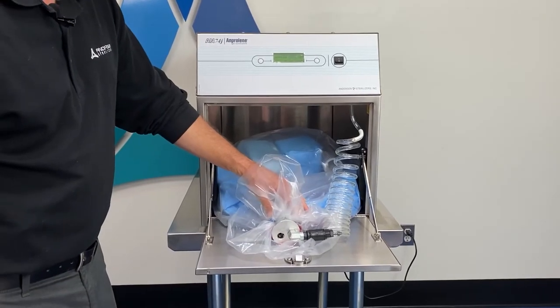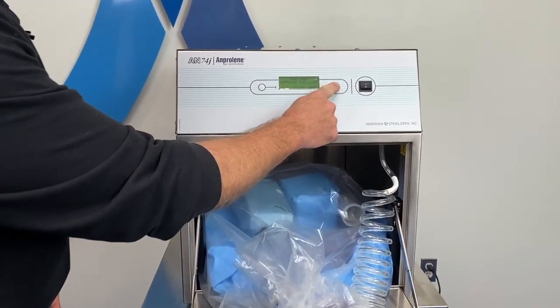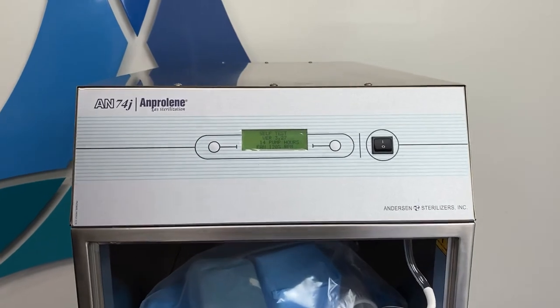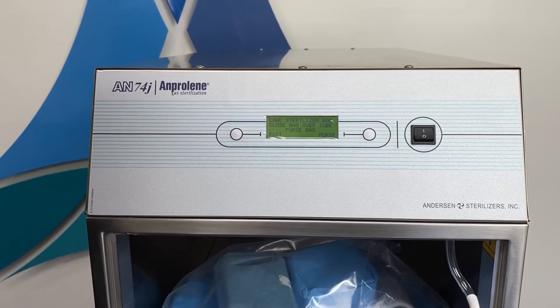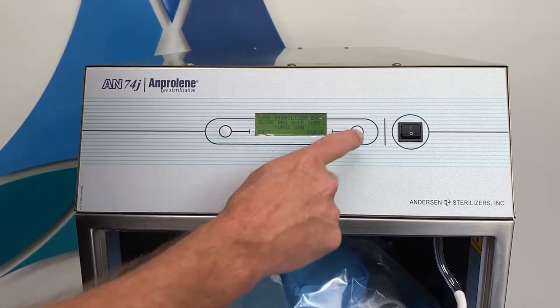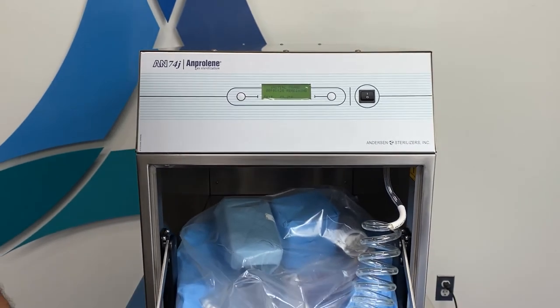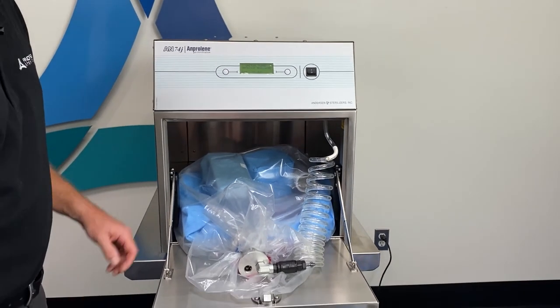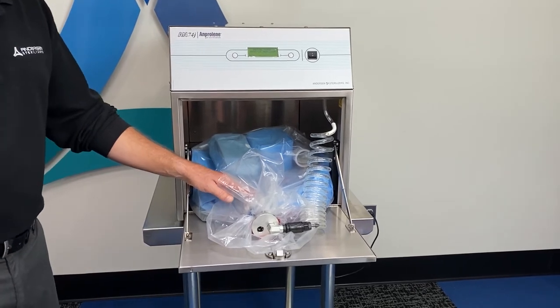Once secure, you'll hit your start button on the sterilizer. It will run a self-test for a few seconds and then give you an option to purge the liner bag. You'll press the button to purge, and the sterilizer will then start to purge any air out of the liner bag.